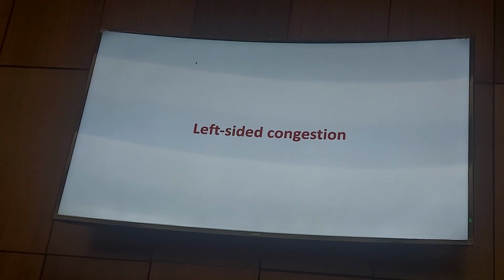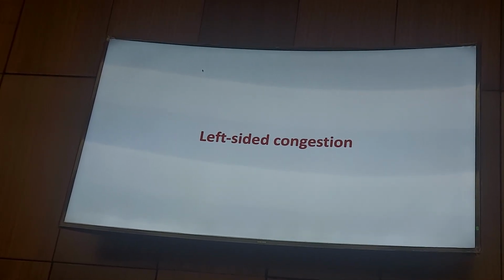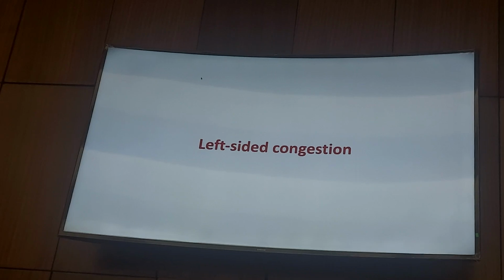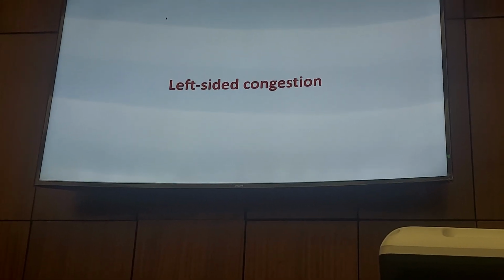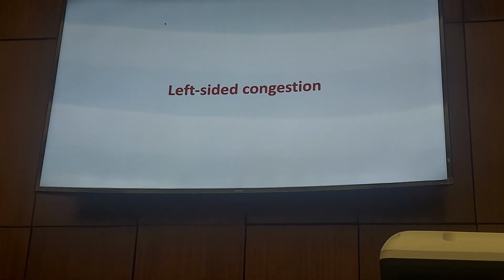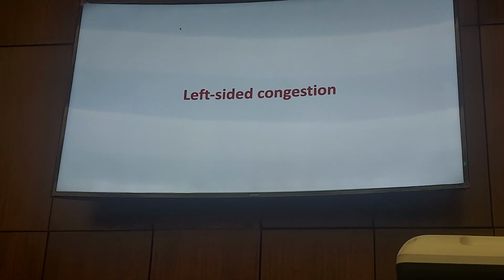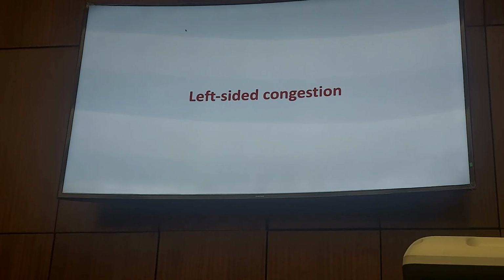And we didn't include the jugular venous Doppler approach, which, maybe even in the paper you showed in 2019 regarding delirium, reflects the concept of congestion and the afterload of the brain better than the hepatic vein and portal vein. This is the theoretical question. And the practical question is regarding the assessment of these Doppler waves in these multiple veins. Do you need a certain preset different from our preset for cardiac assessment or not?